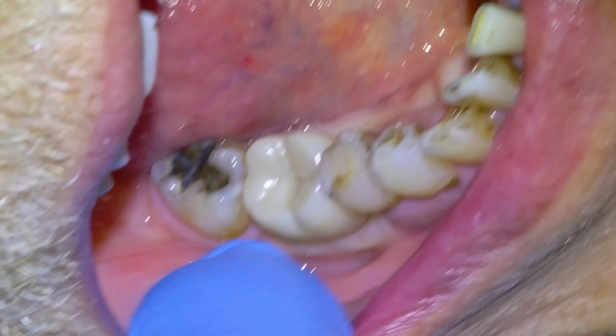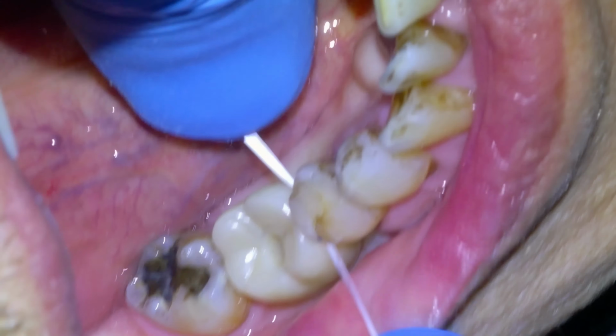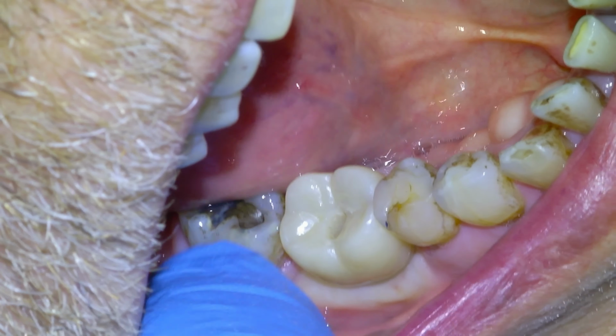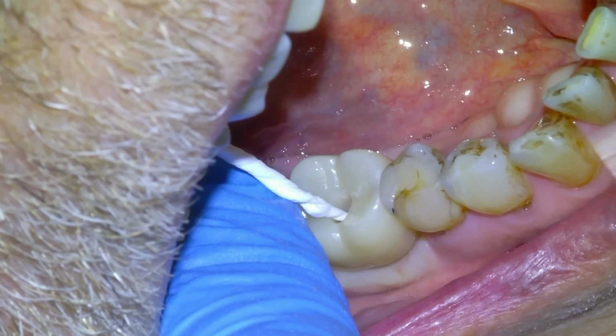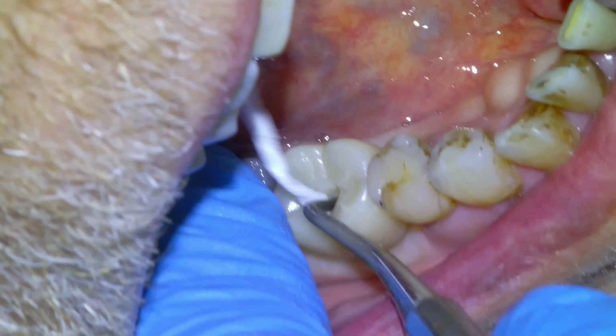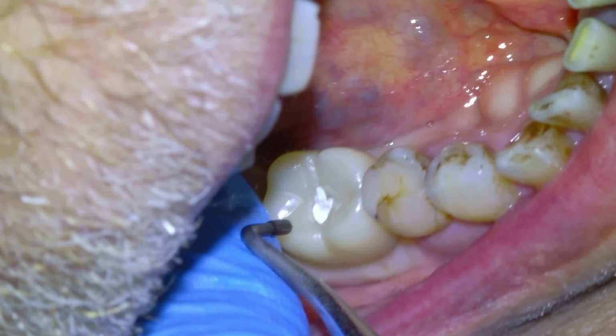Okay, let's check the floss there. Okay, that's about what we like to see. So we'll close it up like that. Bite feels comfortable? Yeah, I'm good for it. Okay. That went on much less painfully. Good, yeah. I think this tightness was what was blocking it out. And that should be just right.